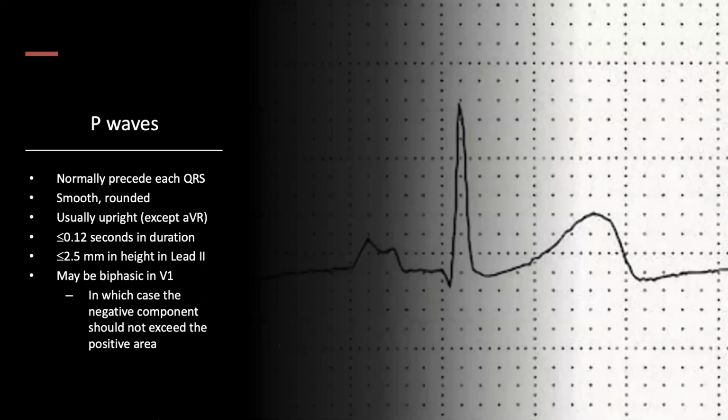P waves, gotta love a P wave. Are they there? Are they not there? What do they look like? Are they bumpy? Are they doing what you're expecting them to do? And if they're not, thinking about what some of the causes of those might be.